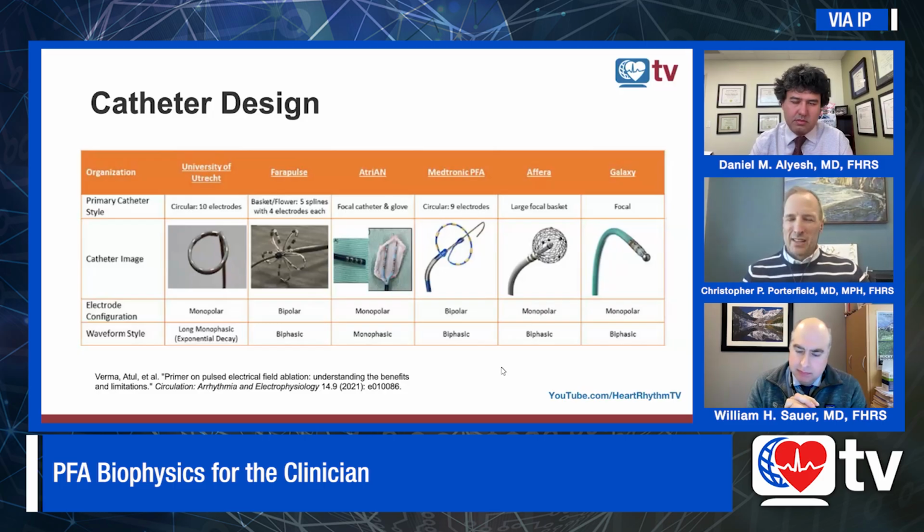The monophasic catheters are having to give more energy to get the same effect. They have more thermal effect. So there's more heating with the monophasic catheters. We're trying to push the limits of that because we want to be in the ventricular space soon, and trying to get that 8 mm plus thickness that we all want more of.